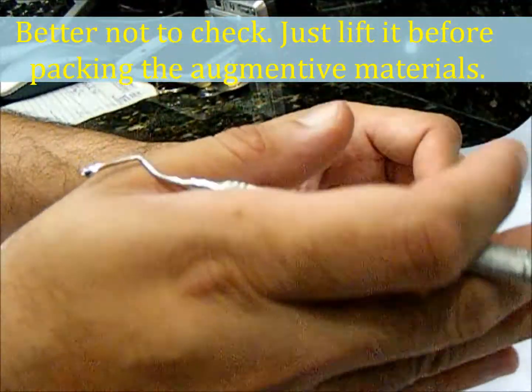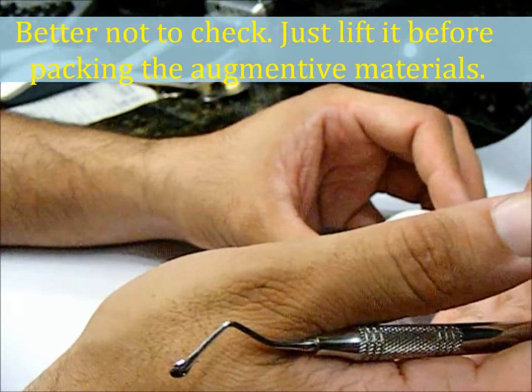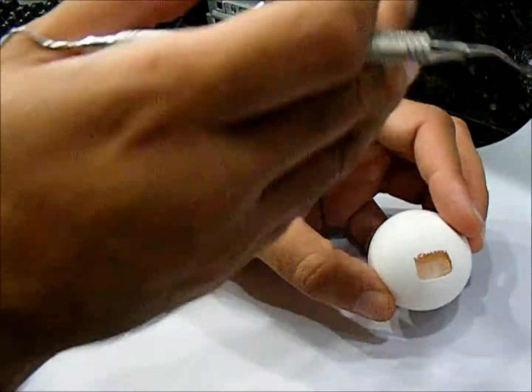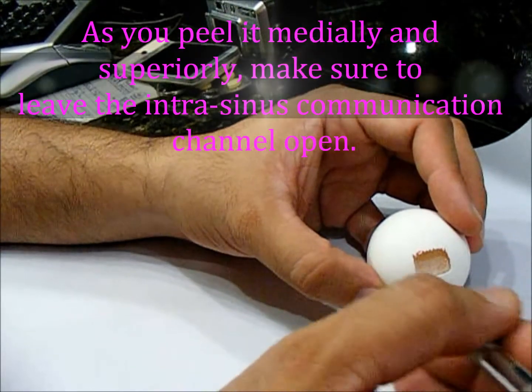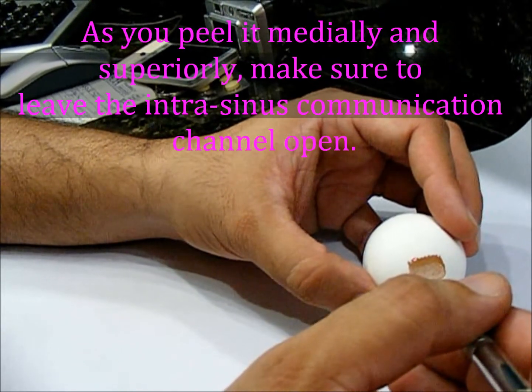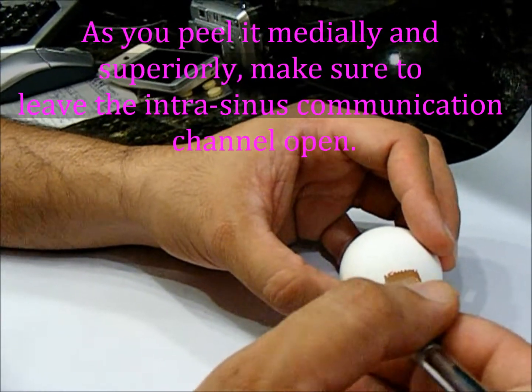The idea is to peel it inferiorly, anteriorly, and posteriorly as needed, but you also need to peel it medially — which is towards the nose, upward. Once you have done this, you can take fresh blood from here and mix it with your bone graft, incorporating into the allograft the platelet healing factors, growth factors, some fibrin, and clot activation.